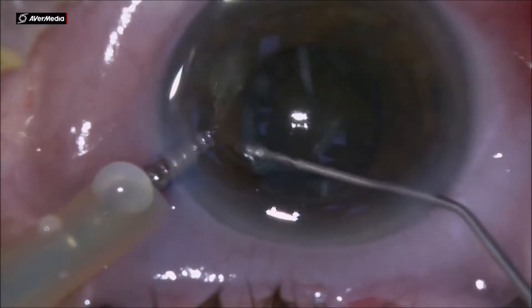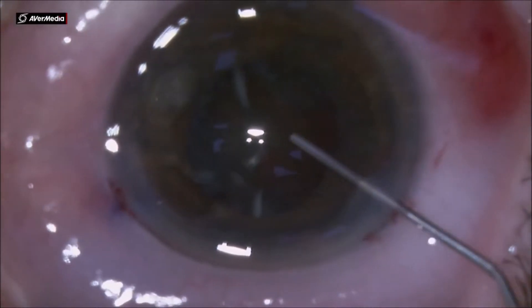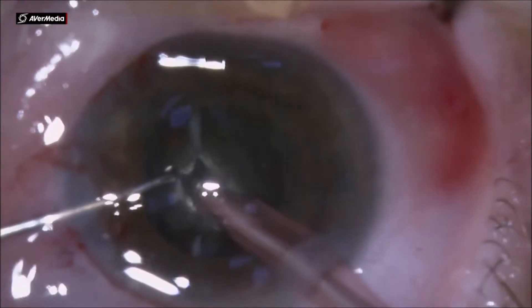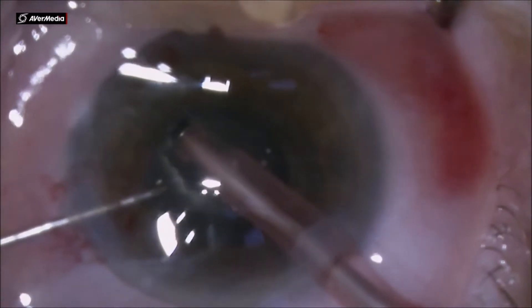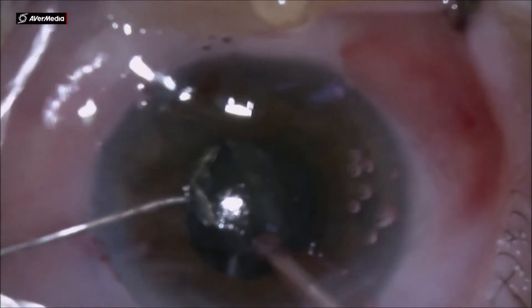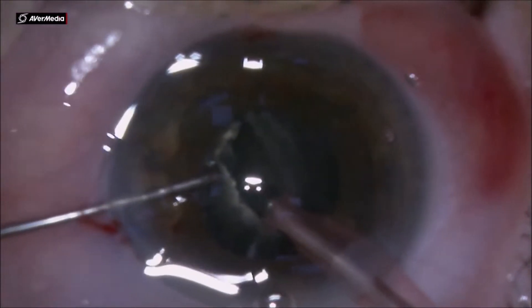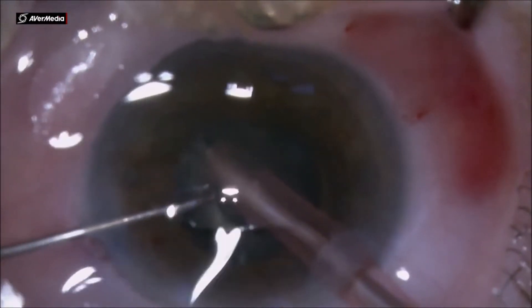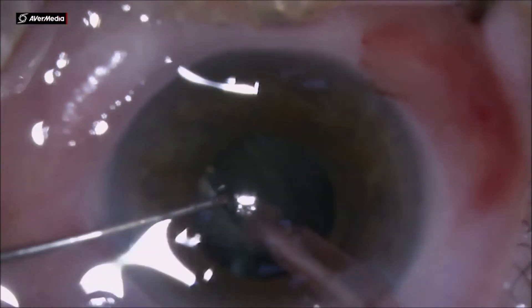I do some hydrodissection here, enlarging the paracentesis to be able to come in with the phaco probe. In this case of a small pupil floppy iris, I prefer to do the stop-and-chop technique. I make a trench a little bit wider than the phaco needle to be able to go with the sleeve inside the trench.